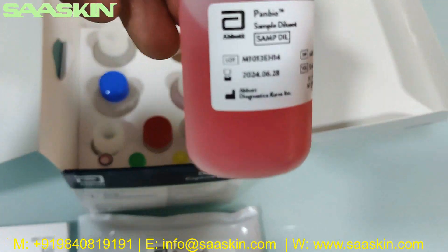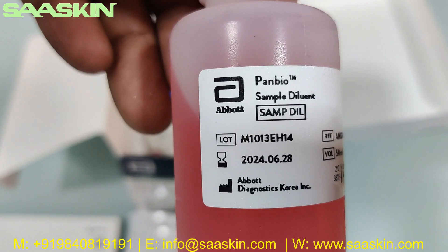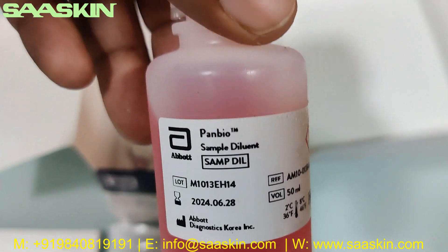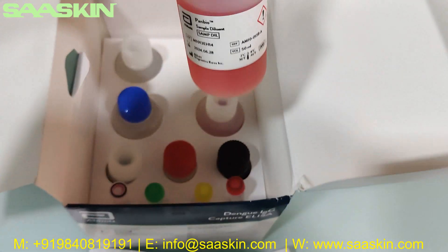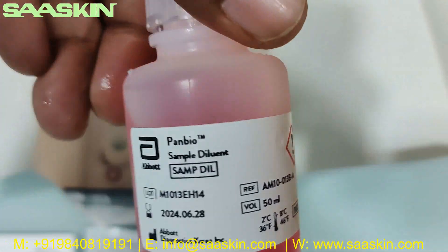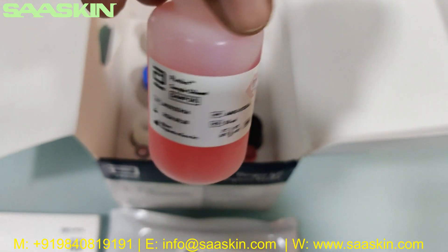Then you have this bottle — this is the Panbio sample diluent, a 50 ml bottle. There is one more 50 ml bottle of sample diluent buffer, so there are two bottles of that.